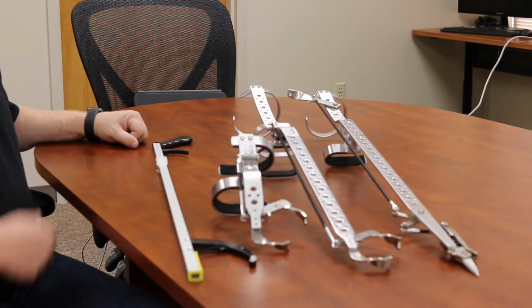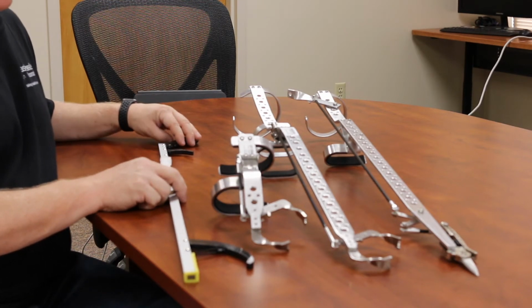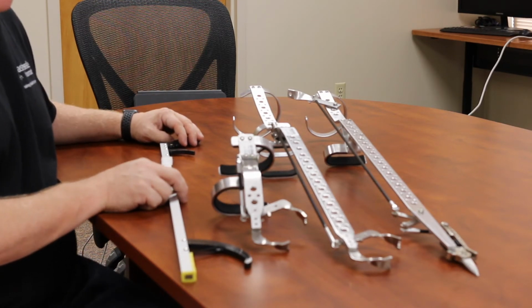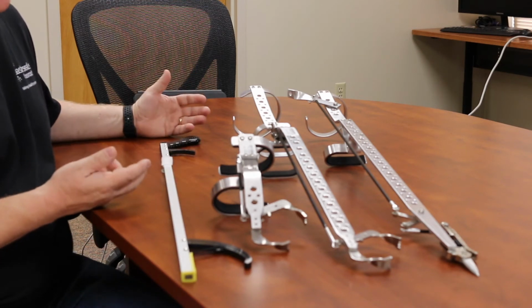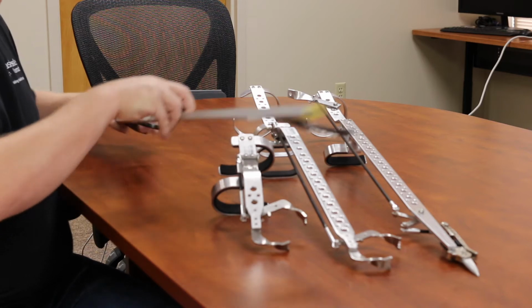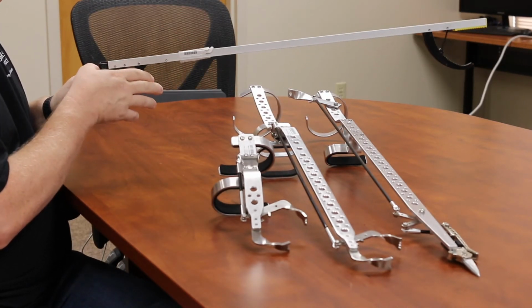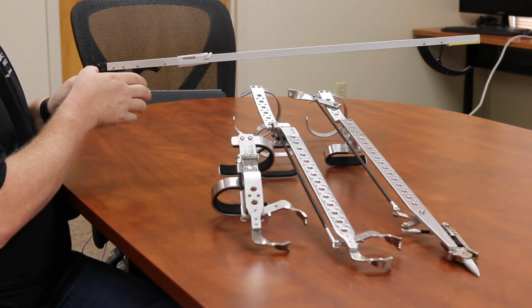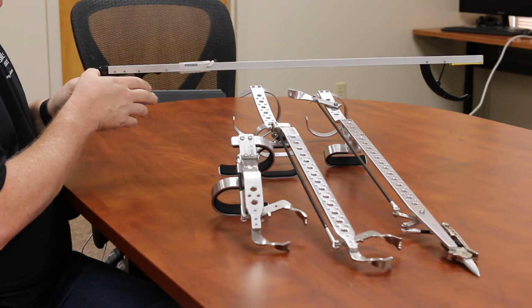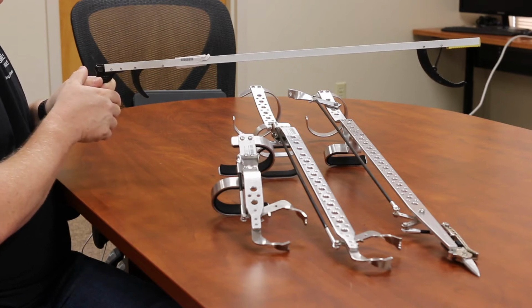And so over here we've got some different types of reachers and grabbers. We've got the traditional one. I wanted to bring this one into this particular tech tip simply because I think it's helpful for us to see how you typically activate a reacher. If I hold this up, notice over here I've got what I like to call the trigger. If I pull back on that trigger, it's activating whatever's on the end of my device to be able to grab or reach for that particular item. And so I'm doing this type of movement to make that happen.